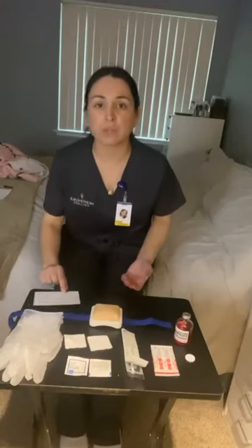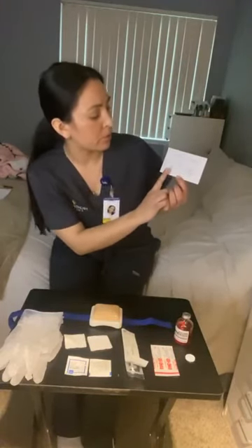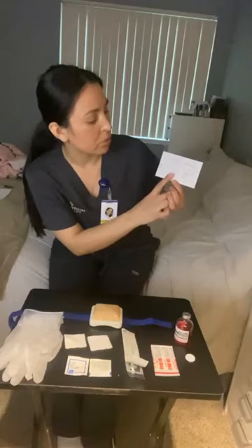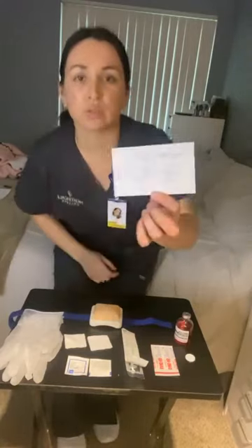I'm going to check the medication order in the EHR. I'm going to do any dosing calculations. At this point, I use dimensional analysis. So I do the order dose times what's available. And so I got 1,000 units over 1 dose times 10 milliliters over 10,000 units. And I got 1 milliliter per dose.